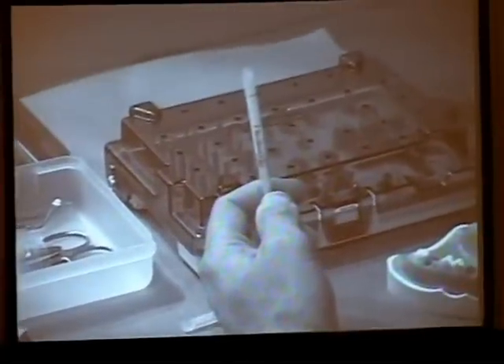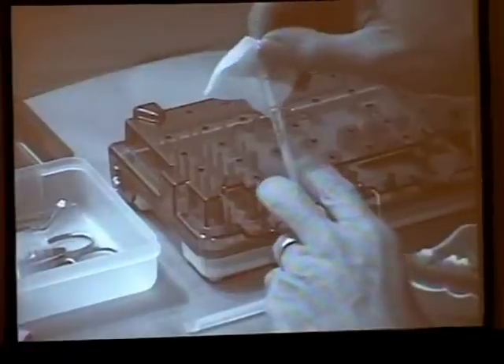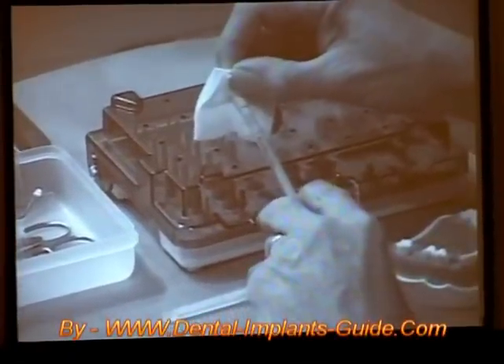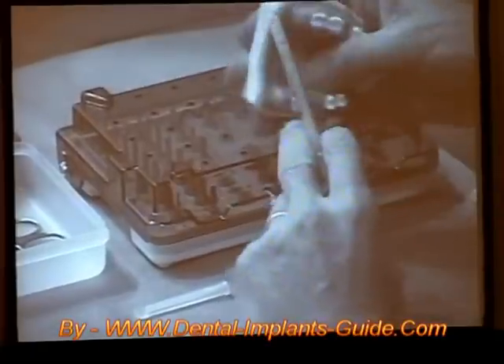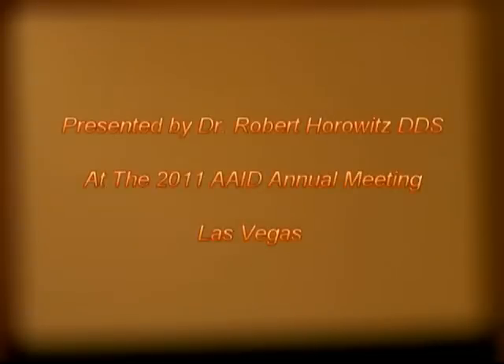Once you have it, you're going to take your piece of gauze, put it over the top, and just squeeze the excess water into the gauze. You'll generally get within a millimeter or so of that mark. Squirt it in the hole. It is really, truthfully, as easy as that.